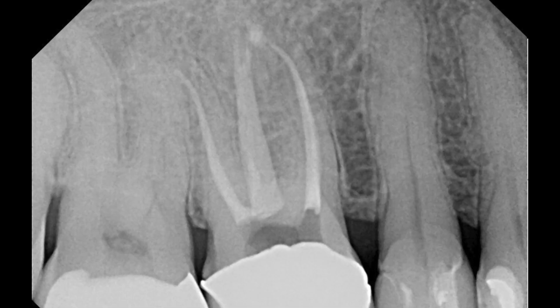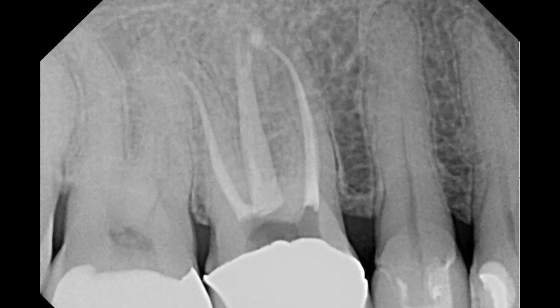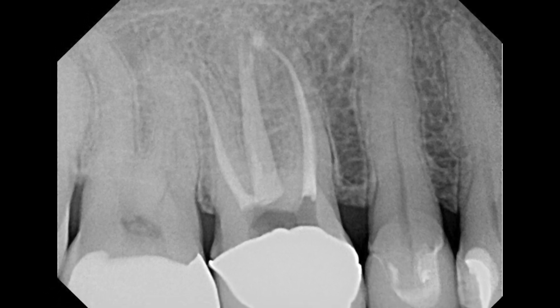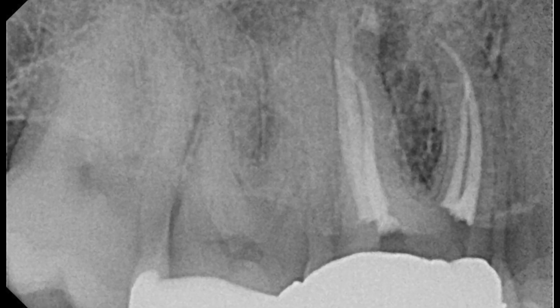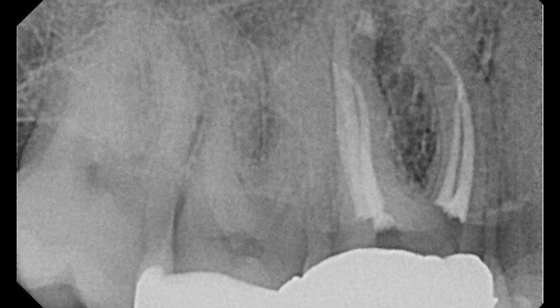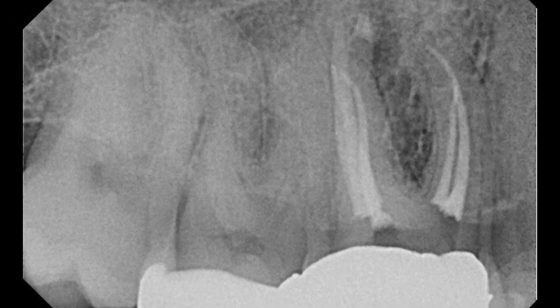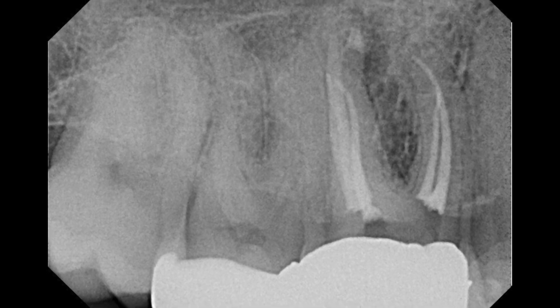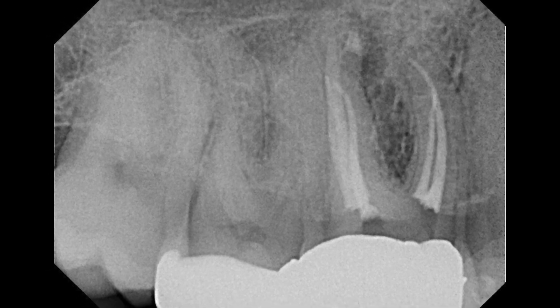The post-operative radiograph shows the wide canal configuration in the palatal root in this four-canal maxillary first molar, and we can see the two mesial buccal canals joining at the apical third of the root, which is a common finding.